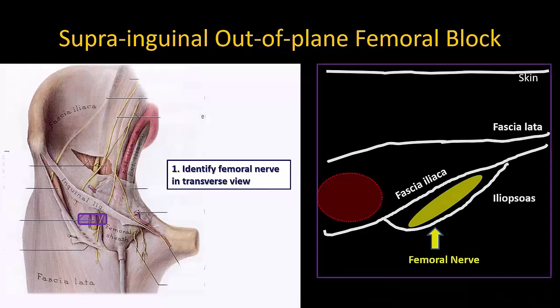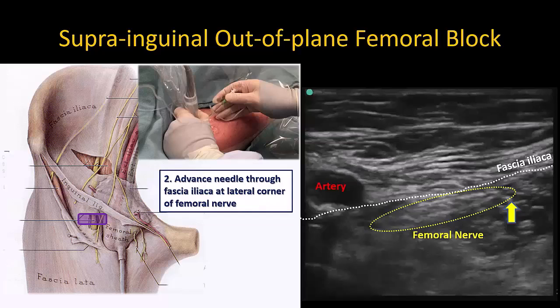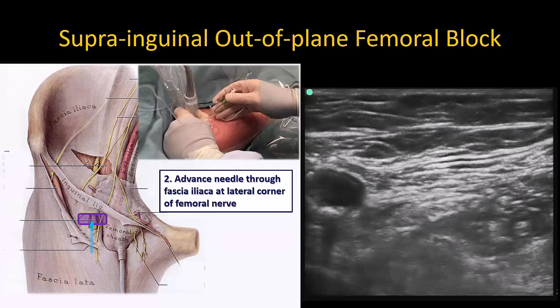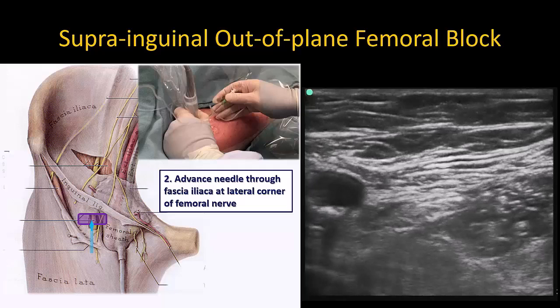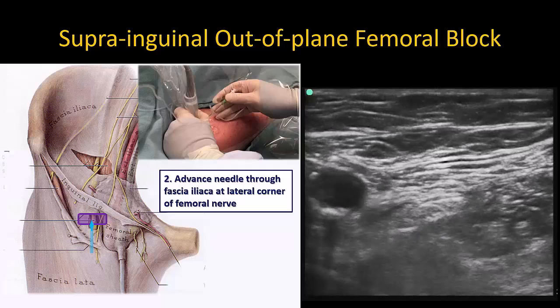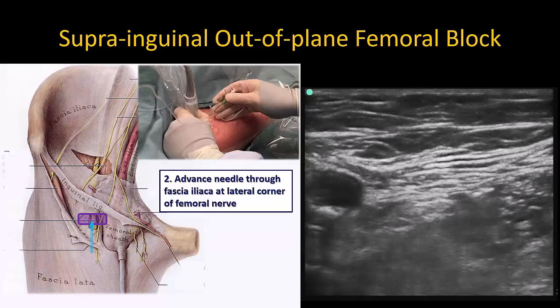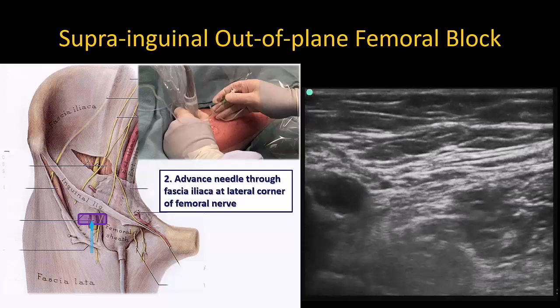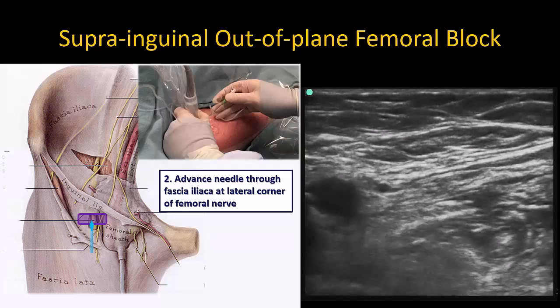Start by imaging and identifying the femoral nerve in transverse cross-section close to the inguinal ligament. This is described in detail in my video on the femoral nerve block, so I will not elaborate further here. Enter the femoral nerve compartment under fascia iliaca, just next to the lateral corner of the nerve, using an out-of-plane approach at a 45-degree angle. The correct needle tip position is confirmed by the expected expansile spread pattern next to the nerve.